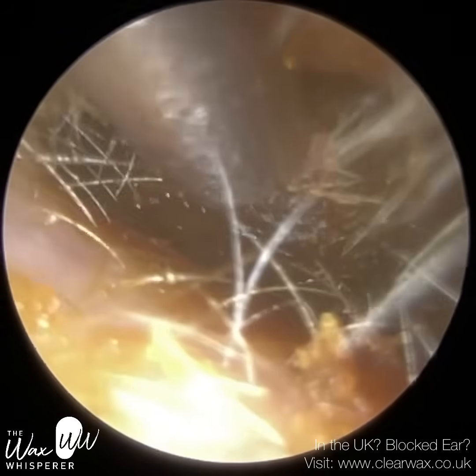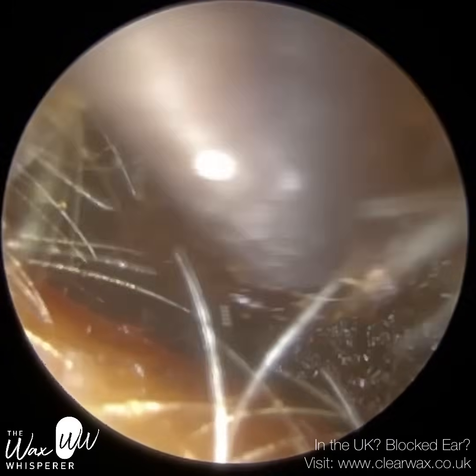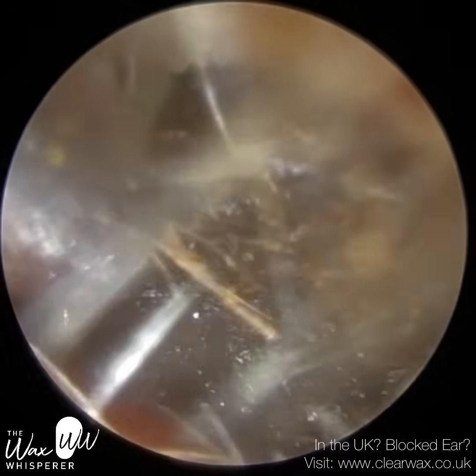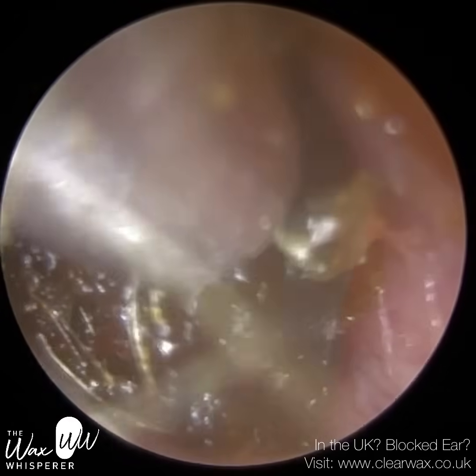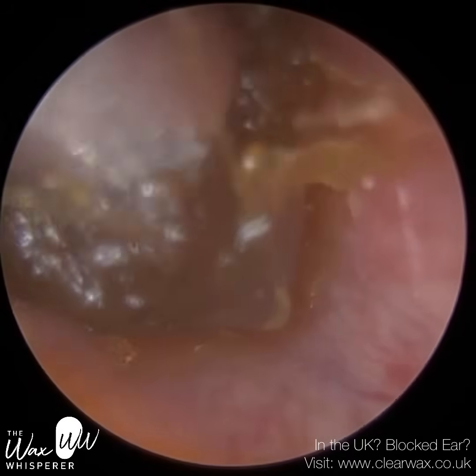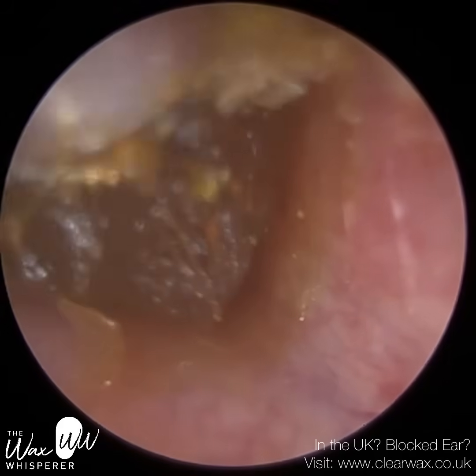In part that was due to the severity of the occlusion and the consistency of this wax — it's very stodgy and sticky, so it's creating an airtight seal against the ear canal wall. They also have a very, very narrow ear canal. I'm using our standard Zolnir suction probe here and it only just fits within the ear canal, so there's very limited space for me to manoeuvre the Zolnir suction probe.